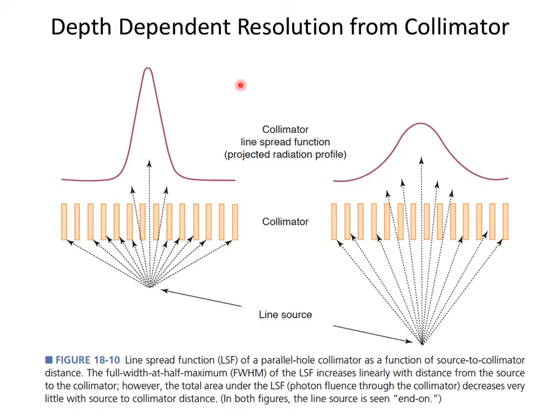For the heart, we would like to determine that to within a few millimeters, because the heart wall is only 10 millimeters thick. So we want to know within a couple of millimeters where that signal came from. And we would like to do it relatively quickly, not over 4 hours, but maybe over 4 seconds, and maybe over 4 milliseconds, even better.